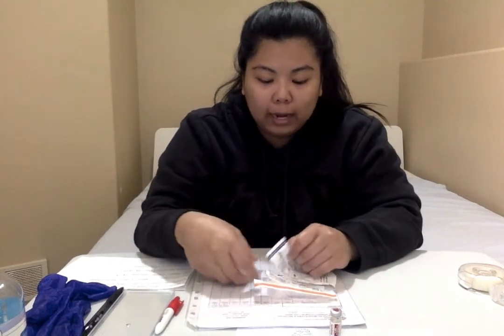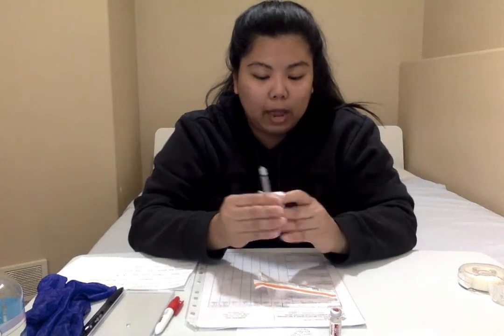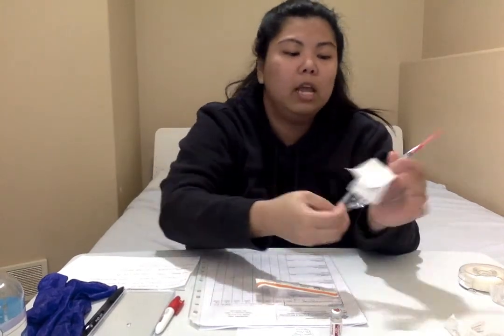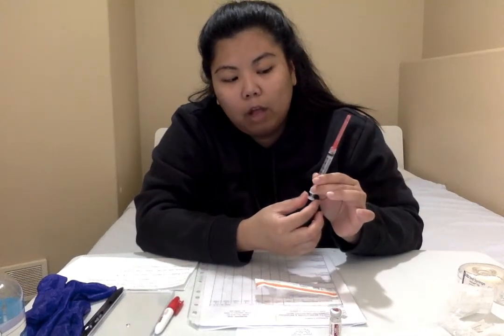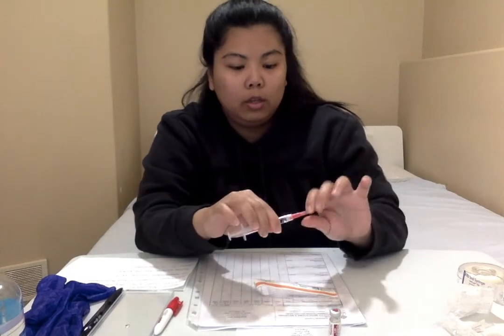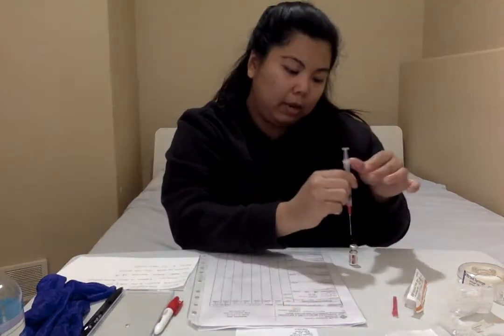So that's dry now. So we're going to draw up our medication now. So I will be connecting my syringe to my blunt fill needle and then securing that in place. We're going to draw up half an ml of air, and then we're going to inject that into our vial. So I'm going to take the cap off, and then I'm going to inject the air.